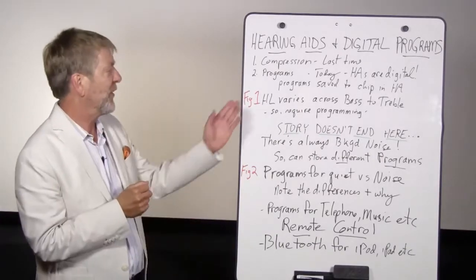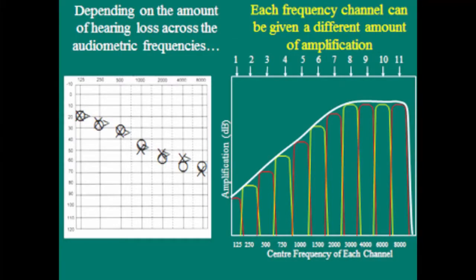If you're looking at the first figure here, you'll see a picture of someone's hearing loss, the X's and O's on the left-hand side of that figure, showing you the audiogram or test results from someone with typical presbycusis. Presbycusis is hearing loss due to aging, and it's by far the most common cause of sensorineural loss today. Presbycusis usually shows hearing loss in the treble frequencies, better hearing in the bass, poorer hearing for high-pitched treble sounds. We call that the trouble with treble. At any rate, if that's the case, hearing aids should be programmed uniquely in order to provide very little amplification for bass because the person's hearing is good in the bass, and lots of amplification for treble.